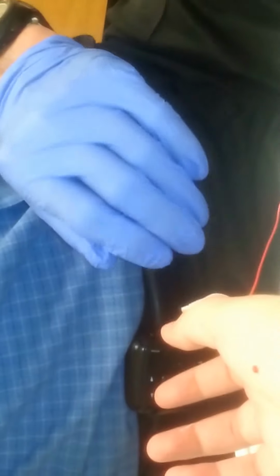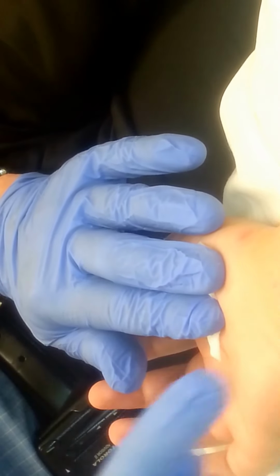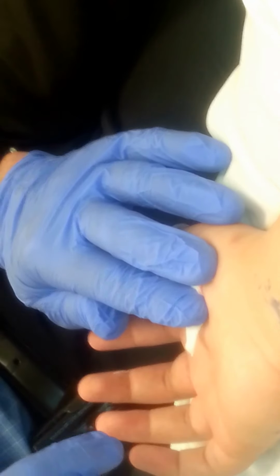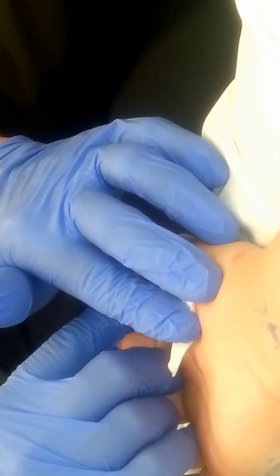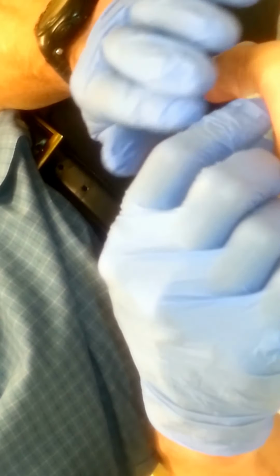All right, let's see what they said. I think they only wanted the right, but let's do a little comparison just so you don't have to go through it again, okay? We'll do the shocks to the muscle, and we'll look at the sensory nerves to the fourth finger and the thumb, okay, which will give us the radial, ulnar, and median nerves, all 3 of the sensory, because this is the most affected side, and you have normal nerve function. So what does that mean? That means that your pain and some of the numbness may not be coming from nerve injury. Could be coming from overuse of muscle or previous strain or sprain. Or you may have a carpal tunnel, but it's so early that we're not picking up any abnormalities yet. And that can happen. The first test can be normal. Sometimes the second one 2 years later is normal, and sometimes 5 years down the road we can see some slowing across the wrist. But right now, looking good.